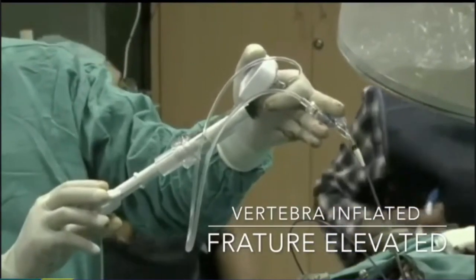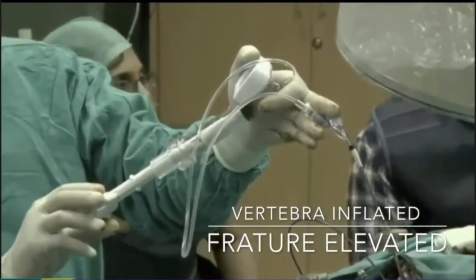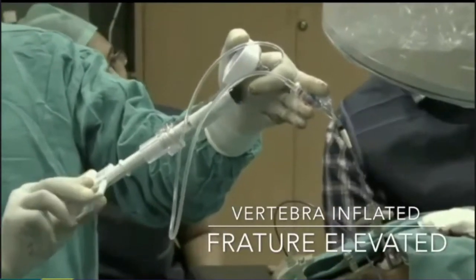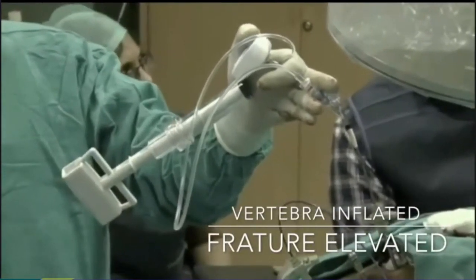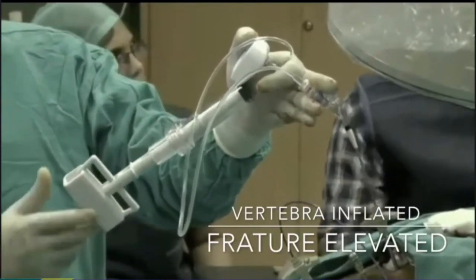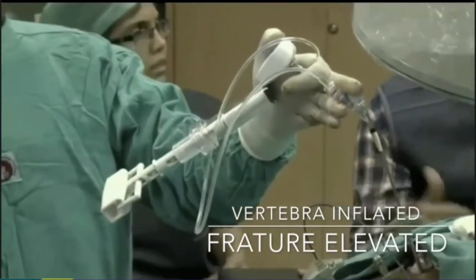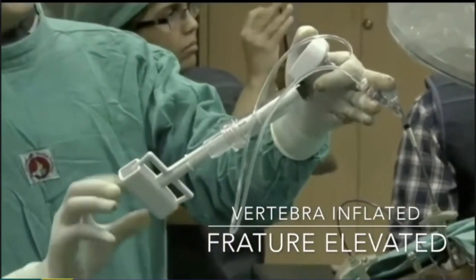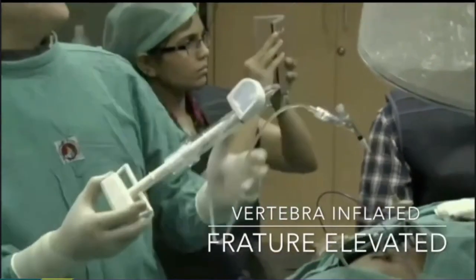So you don't have to worry. Keep your second balloon ready and start with that. But before you put the second balloon, wash out the dye which has leaked out of the balloon into the body. And then you start the second balloon if need be. If you have already done your job well, I sometimes overzealously inflate just to inflate the bone if it is hard bone, so my balloon burst. I said, it's okay. I don't have to use my second balloon. I go with the cement now. And that is how it looks.